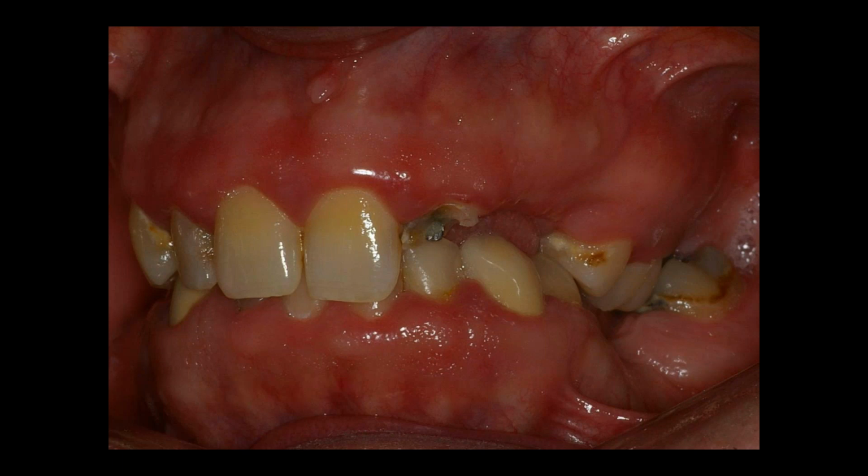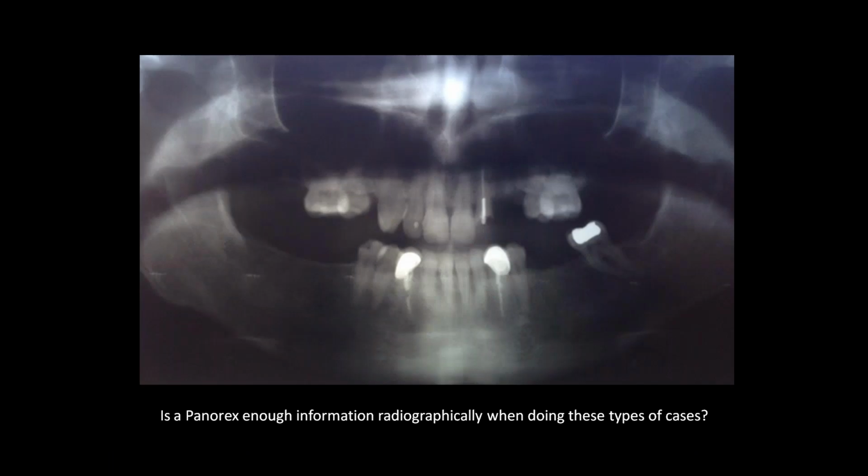When we look at the other retracted view, the side retracted view, we can clearly see that tooth number 14 has hyper-erupted so far that not only can we not place an implant and crown in the area of number 19, but tooth number 14 would need so much crown lengthening that we would end up in the furcation area if we were trying to save this tooth.